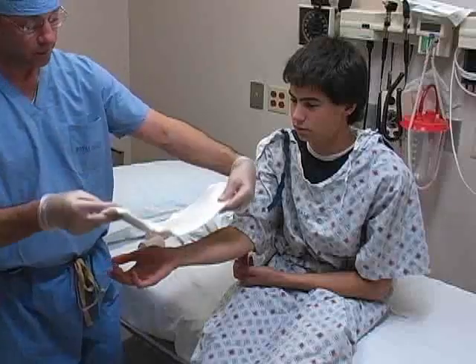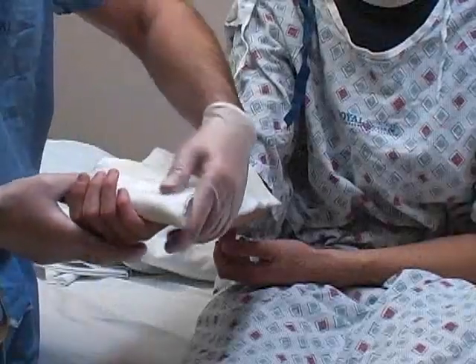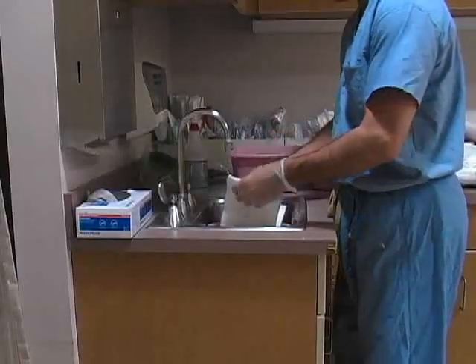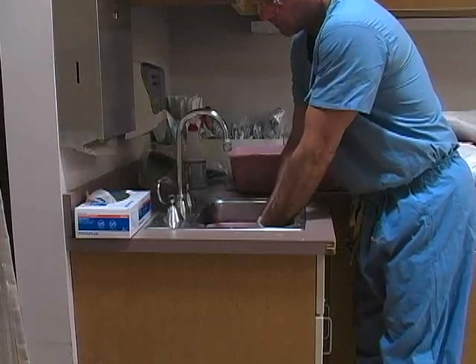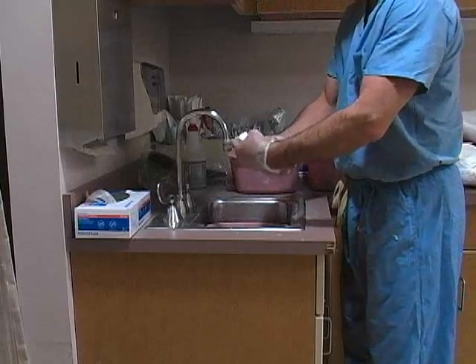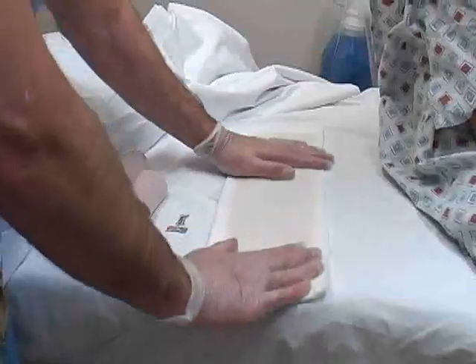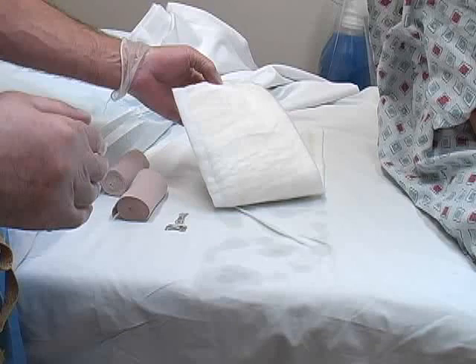Hold the splint next to the extremity to measure the required length. If the splint is too long, it can either be cut to size or folded back on itself. Next, soak the splint in room temperature water. As with plaster splints, hot water must not be used in order to avoid splint-related burns. Place the saturated splint on the bed and run your hands over the surface to assure that the water has equally penetrated all layers of fiberglass.